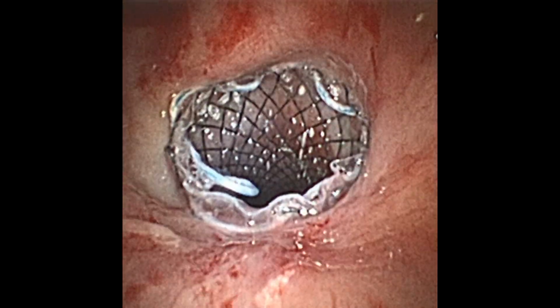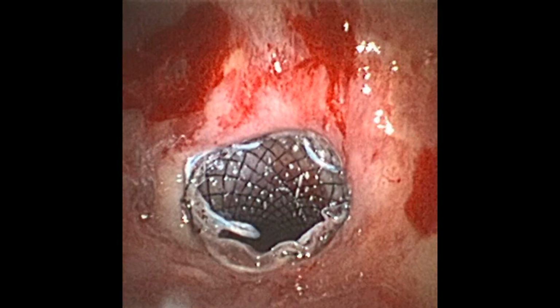And once the stent is gradually pulled up, making sure that the stent doesn't get displaced, now the stent has reached its appropriate location, and now the post deployment bronchoscopy shows a perfect placement of a self-expanding metallic stent for the closure of a malignant tracheoesophageal fistula.